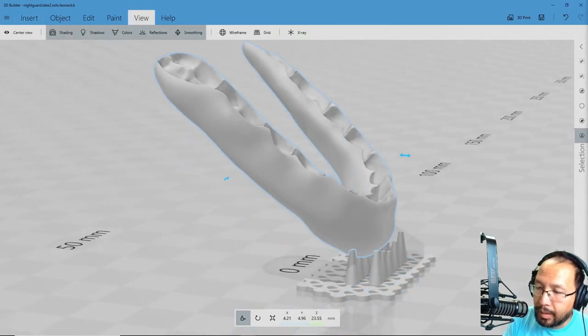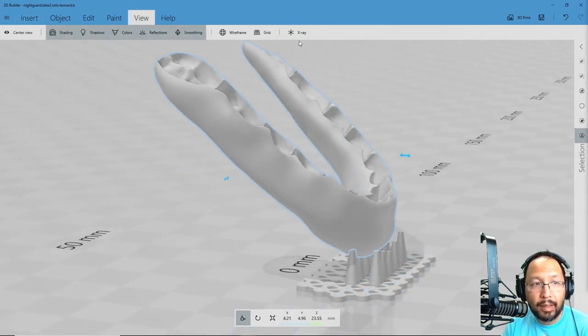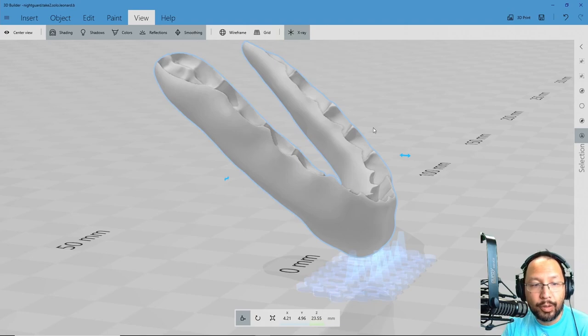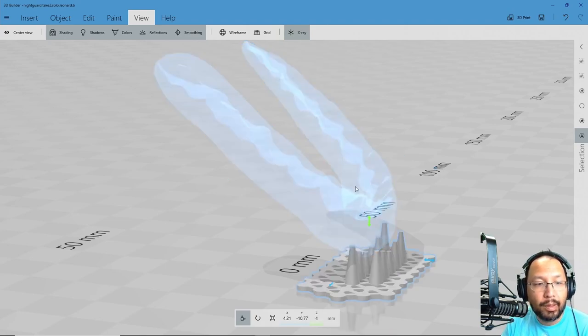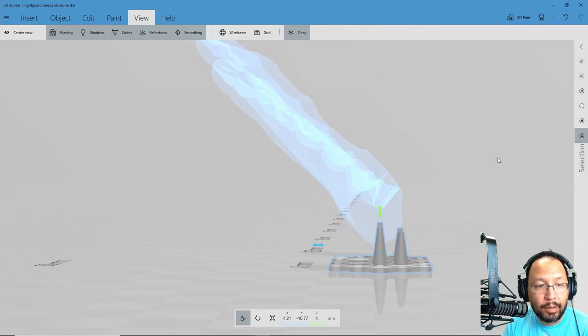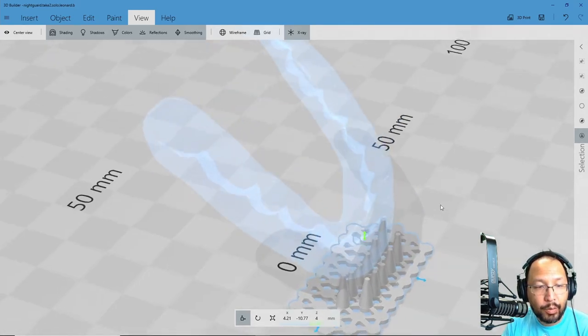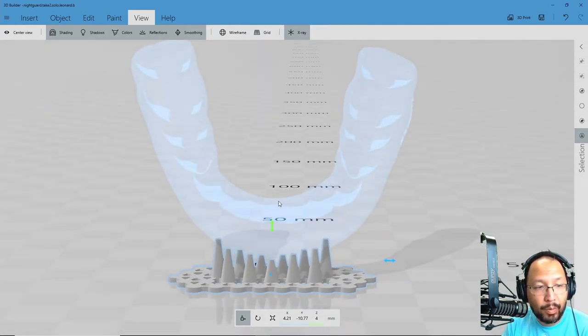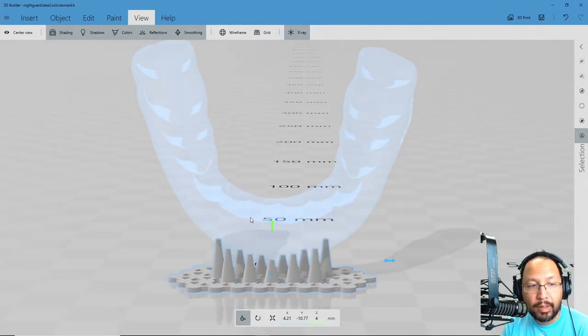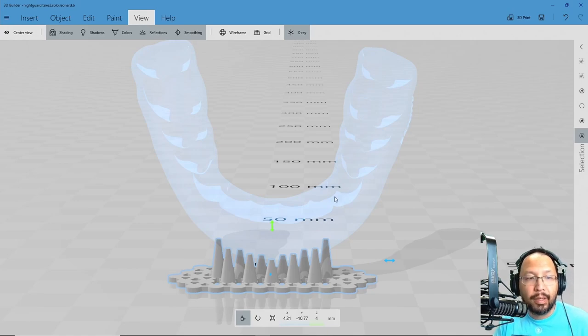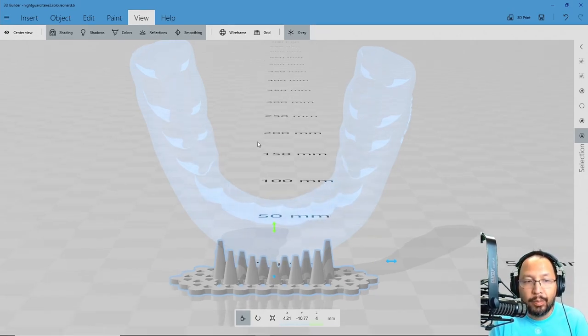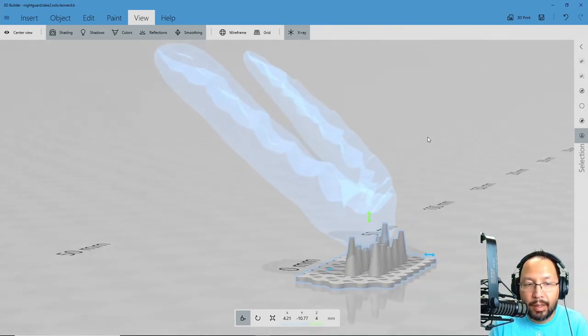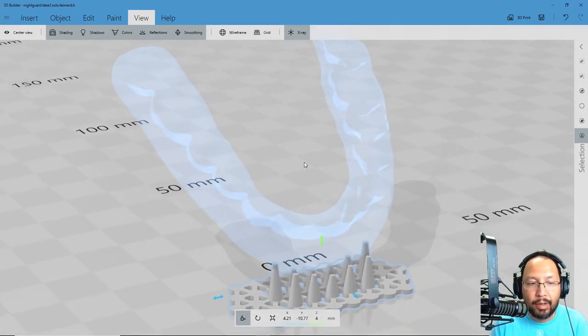So what we're going to do is hit the x-ray feature here. We're not going to do it on that one though. We want to x-ray this one. And you can see there that x-ray allows me to see through the model. We want to look at the intaglio of your night guard and make sure that the spikes aren't into the intaglio.